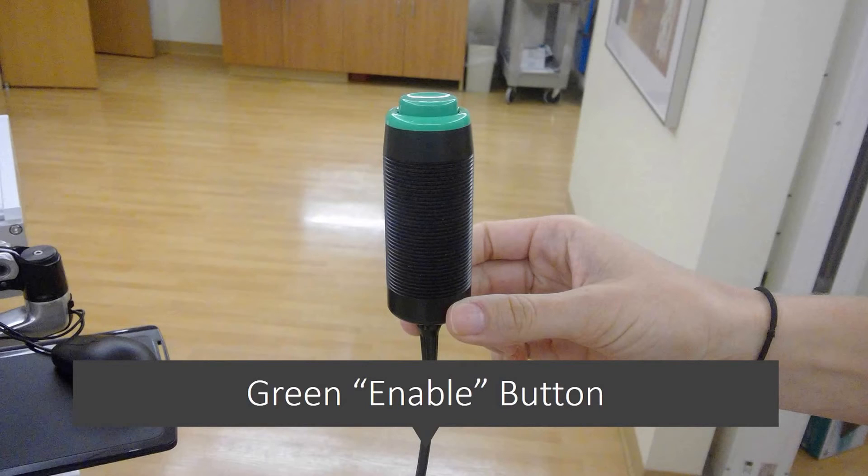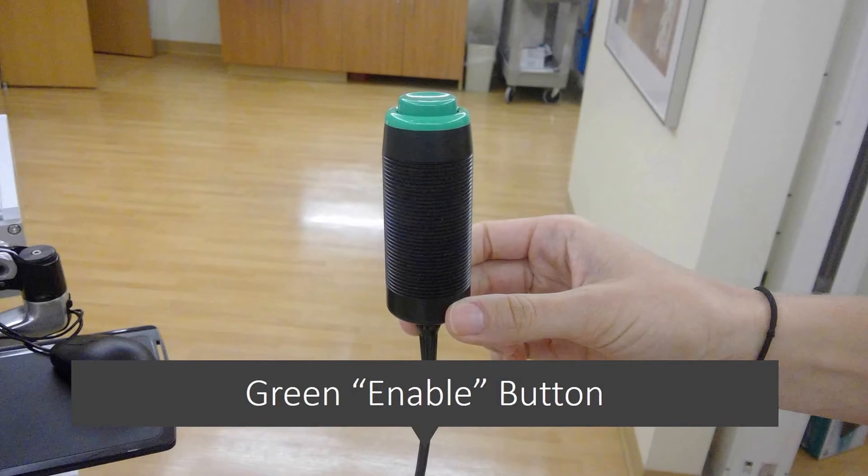If at any point during the treatment you need to breathe or if there is an emergency, just let go of the button and the treatment will stop.